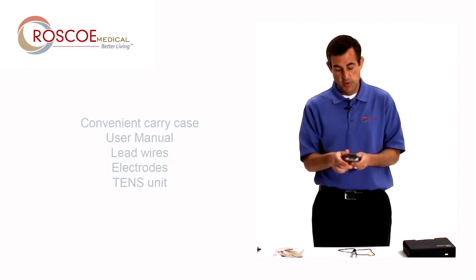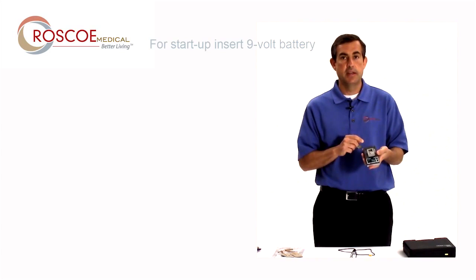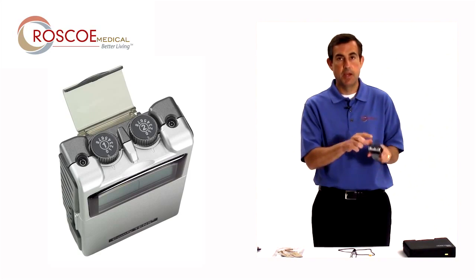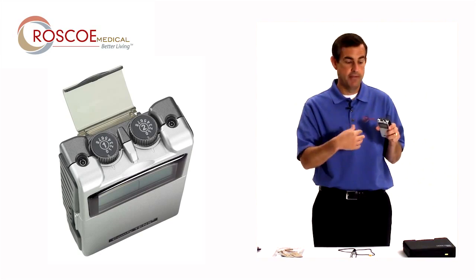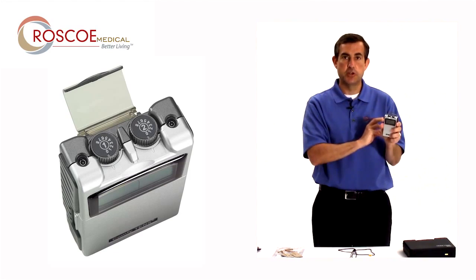So the first thing you do with the unit is in back — you want to make sure you put your battery in. It's a nine-volt battery. Then put the cap back on. The knobs on top are how you turn the 107000 on and off, so you want to make sure they are both in the off position before you start setting up.